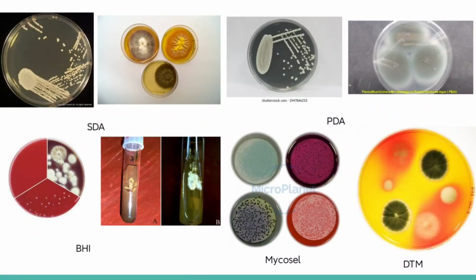Okay, so ito po yung mga pictures natin. This is an example of your Sabouraud dextrose agar na yeast, and this one naman is Sabouraud dextrose agar na mold. Okay, so PDA or potato dextrose agar na yeast, and then potato dextrose agar na mold. Okay. Then this one, we have the brain heart infusion agar. Ito, agar yan. So pwede rin siyang gawing sa tube, slant.